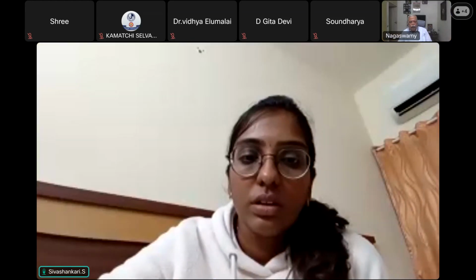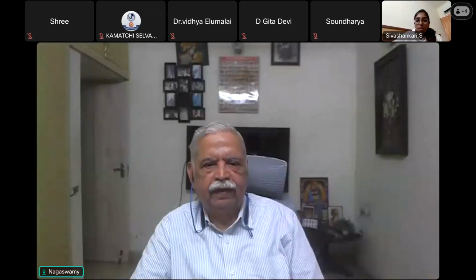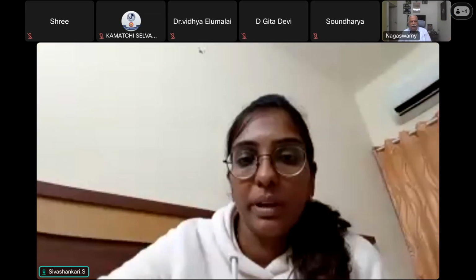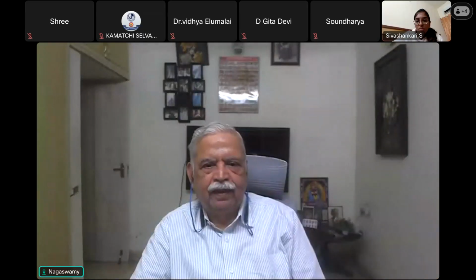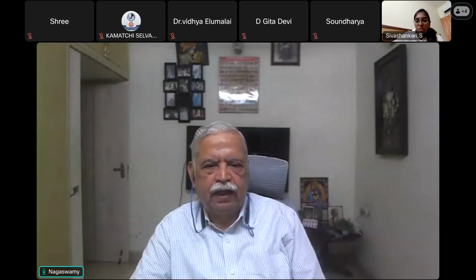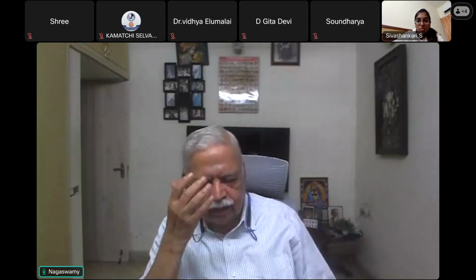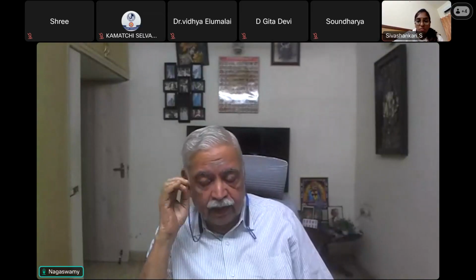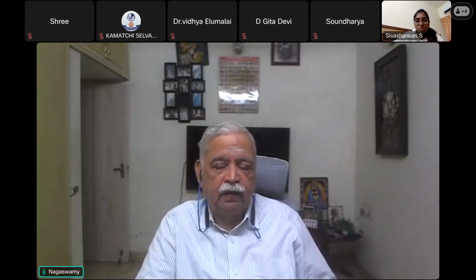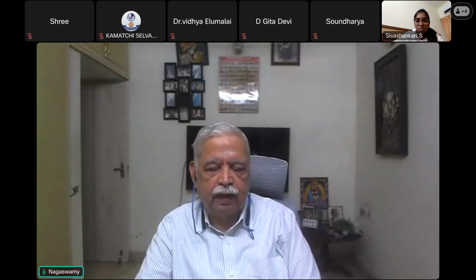FiO2, okay, tidal volume, very good. Respiratory rate, great. And pressure support or PEEP. Okay. You want to set the IE ratio, inspiration to expiration ratio. Okay, and then flow rate, peak flow rate. All these parameters have to be set so that the set tidal volume will be delivered and the minute ventilation will be supplied to the patient. Okay, these are the parameters.